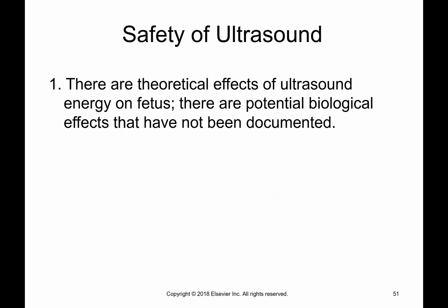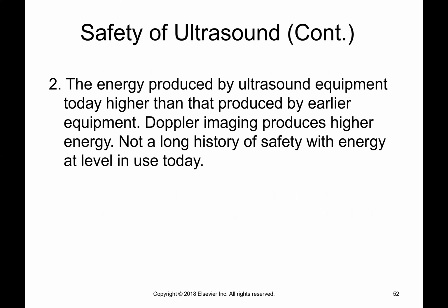Now, the safety of ultrasound. There are theoretical effects of ultrasound energy on the fetus, but there are potential biological effects that have not been documented. So we don't want to just keep scanning and scanning, because we're trying to reduce the amount of ultrasound. You want it to be a great exam. You want to make sure that you get everything, but you also don't want to overdo it.